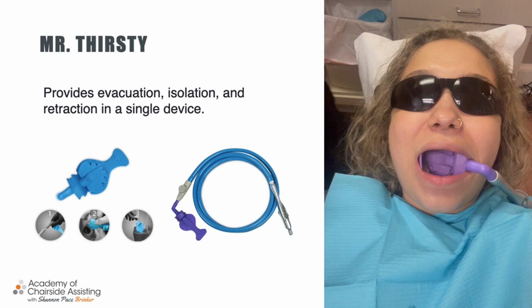And there is something to be said for having your own hose, because some of the hoses we're utilizing are stiff and hard and they don't bend as much as the one that we're used to utilizing. So that's one of the things I think we really have to look at as well: the hoses have to be comfortable and they have to be bendable, right? Because we're not just going to wear them in and down the road they're going to get softer. That's really not going to happen. So we want to make sure that you know that.